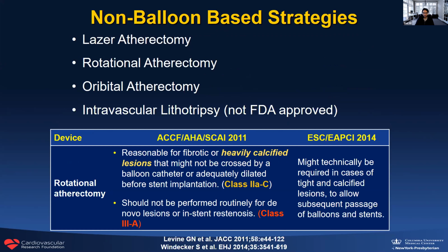Non-balloon-based strategies include laser atherectomy, rotational atherectomy, orbital atherectomy, and intravascular lithotripsy. I should remove that because when I made this slide deck, it was not FDA approved. Of course, Shockwave was FDA approved on Wednesday in the United States.